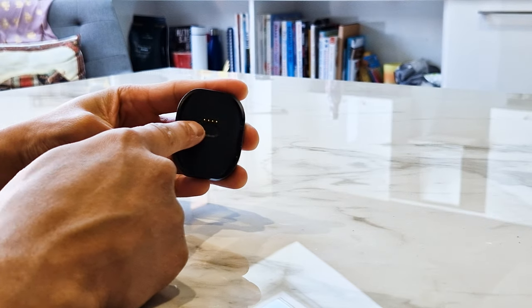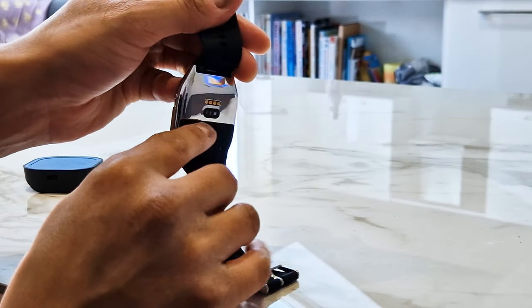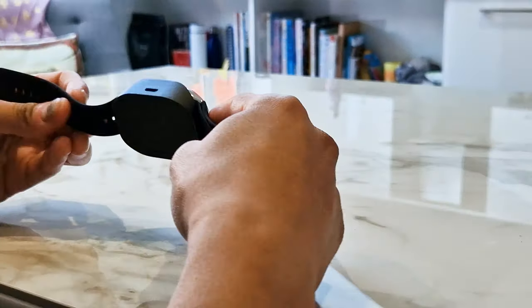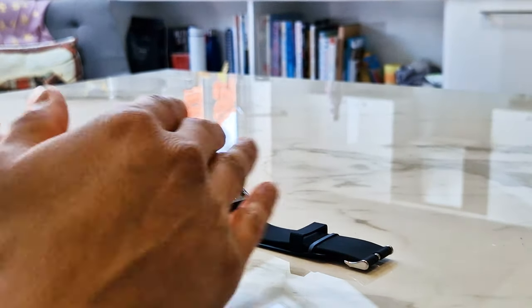Here's a look at the charging dock. It's not magnetic — it has four pins that attach onto the back of the watch. The way it works is you clip it in and once it's clipped in it's solid, it's not going anywhere. You do need two hands to get it in and out since it lacks magnetic attachment, but it does the job and lies flat on a table, keeping things neat.